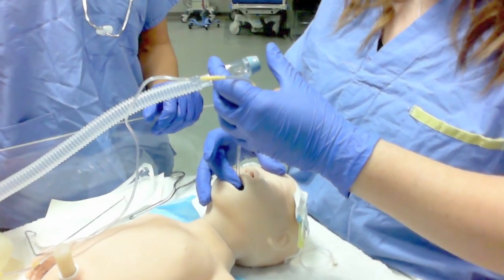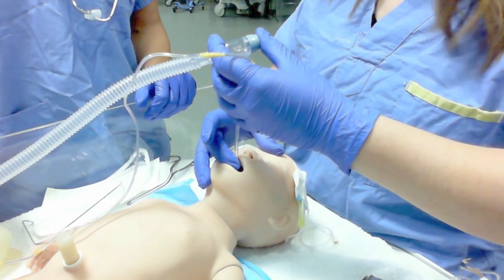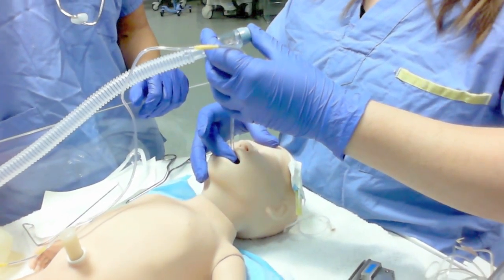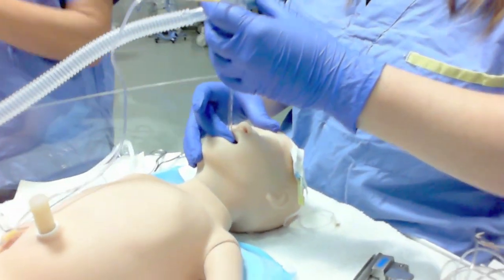Now that the intubation has been confirmed, it is time to secure the endotracheal tube. Based on this patient's weight of 3.0 kg, the tube should be positioned at 9 cm.